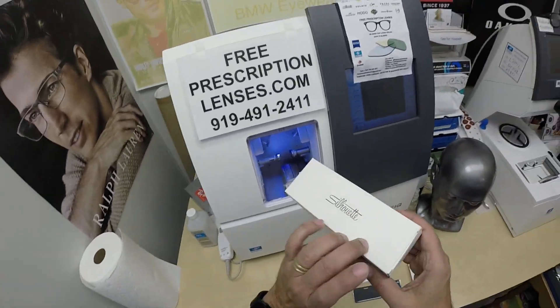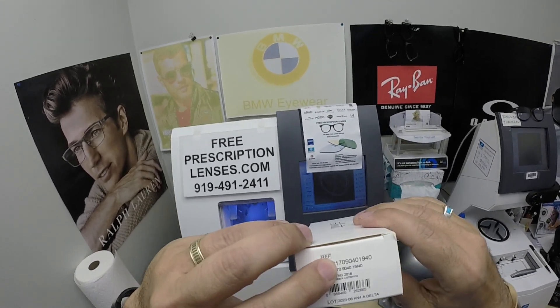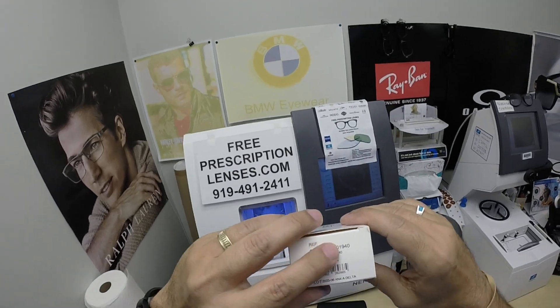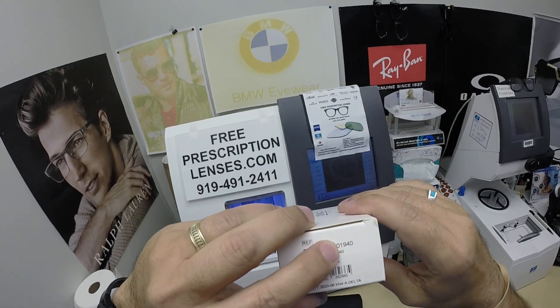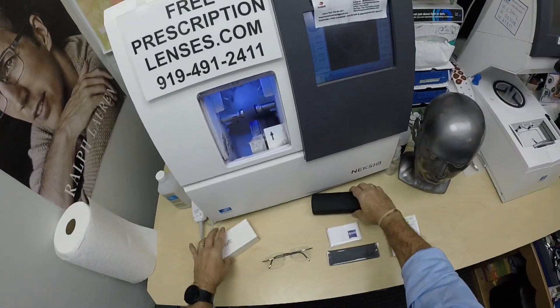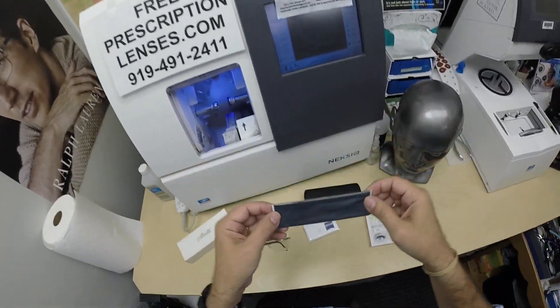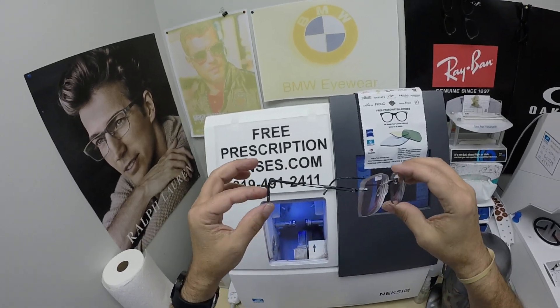When I show you Lee's Silhouette model number 5521, color 7090 — the jet black — 19 bridge, 140 temple length. I know it just says 40 but that's how Silhouette prints. It comes with the Silhouette case, the Silhouette cleaning cloth, and this is the star of the show, the main attraction.